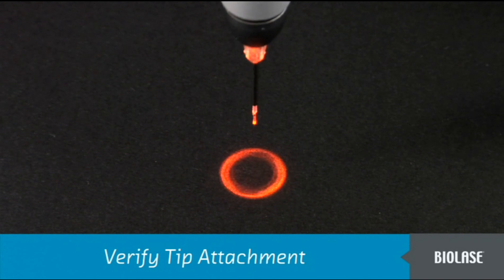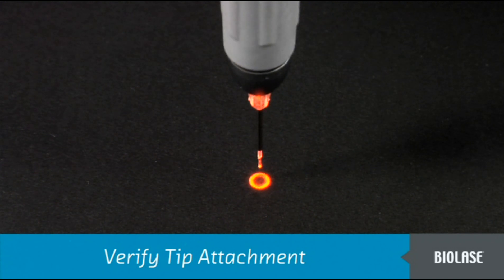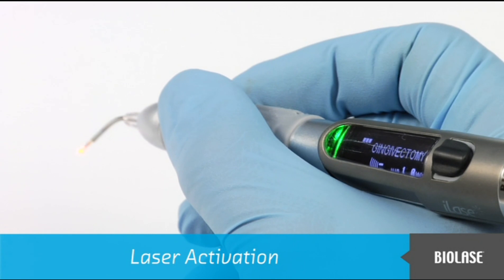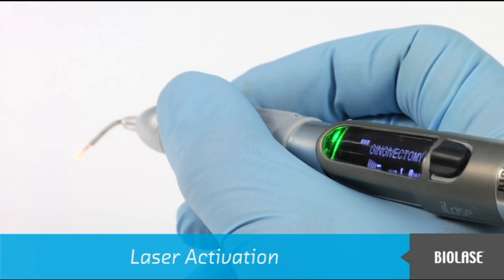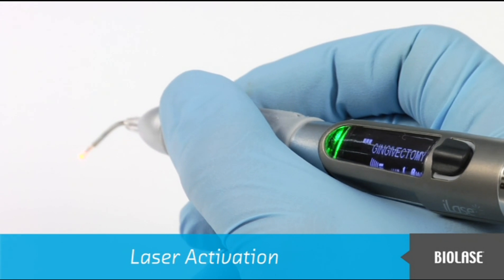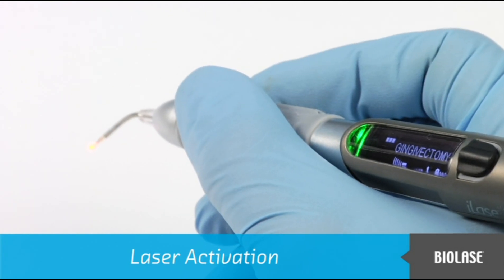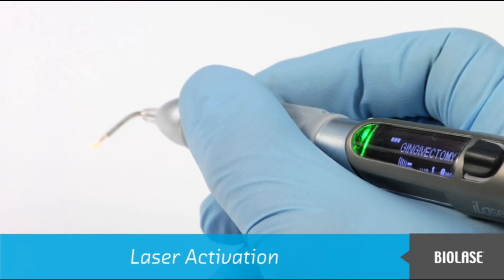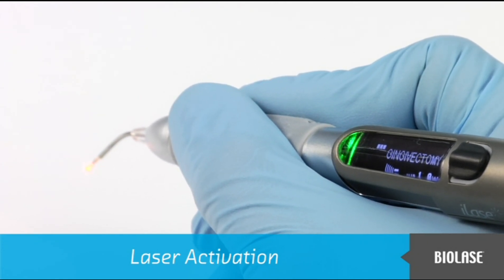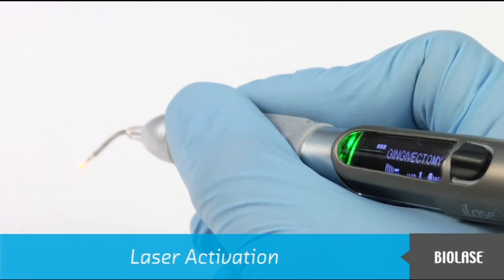To check if the tip is properly attached, shine the aiming beam from a straight tip, without pressing the finger switch, onto a surface such as a tabletop. If the red aiming beam makes a pattern of a circle, the tip is connected properly. The laser can be activated only when the iLaze is in ready mode, noted by a green LED and the red aiming beam. Any portion of the finger switch can be pressed and held to activate the laser. For safety purposes, the laser does not immediately activate — you will hear an immediate beep tone, but the laser will not activate until you press the switch for approximately one-third of a second. When the green LED blinks and the beep tone pulses, the laser is activated. To stop the laser output, simply release the finger switch.